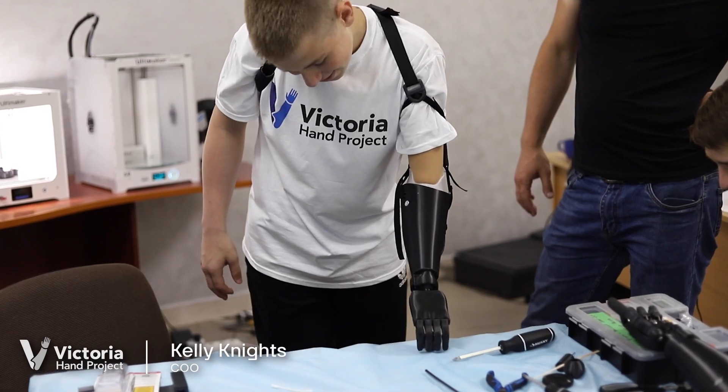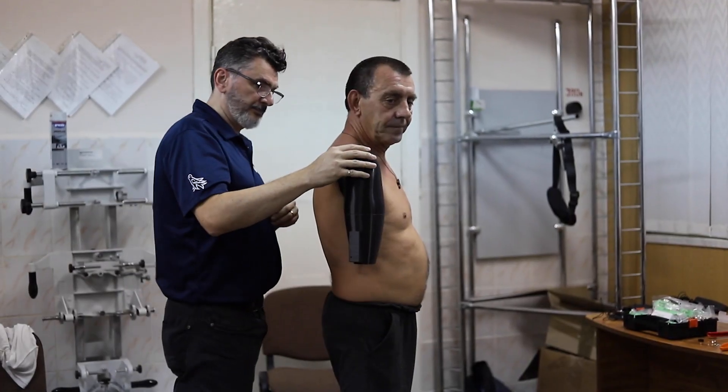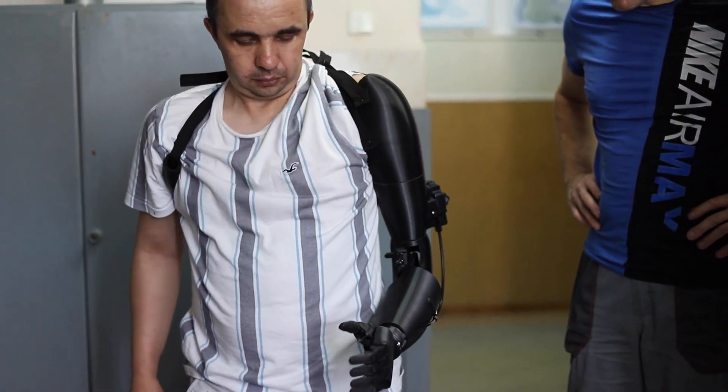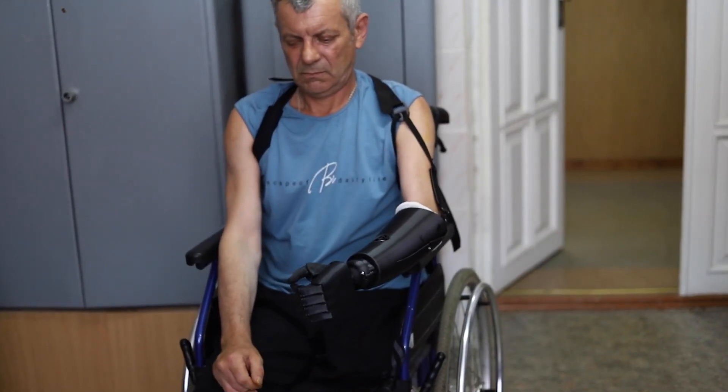Victoria Hand is a body-powered prosthetic device. We also have a custom limb socket for each patient and standardized hands. The patient will receive their custom prosthetic arm. They will put on the harness, kind of similar to a backpack, and by shrugging their shoulders, the motion of moving their shoulder actuates a cable and the hand is able to open and close.